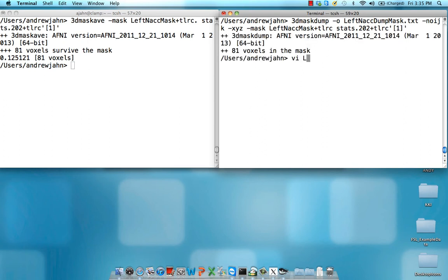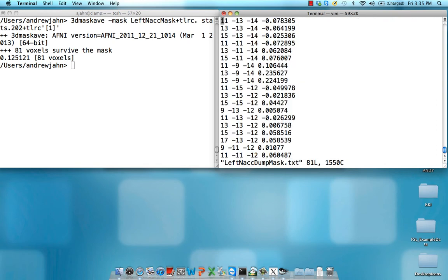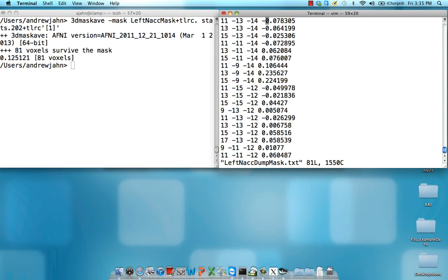So after that, I do get this output data set, left NACC dump mask dot txt. And these first three columns are the X, Y, and Z coordinates, and they're in RAI orientation. So remember, positive is more left and negative is more anterior. And this fourth column right here is the beta estimate, or beta weight, at that particular voxel.